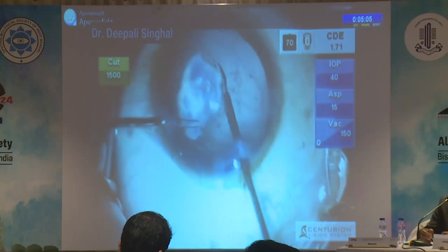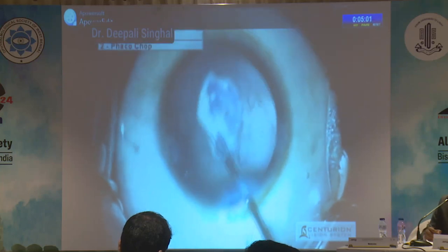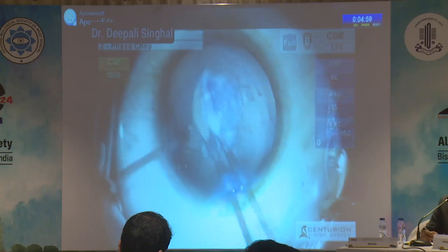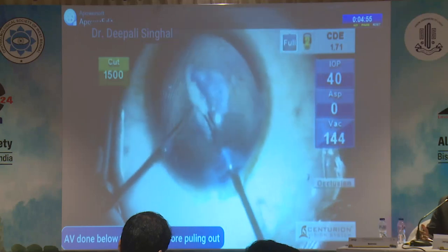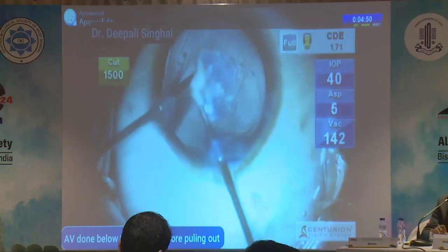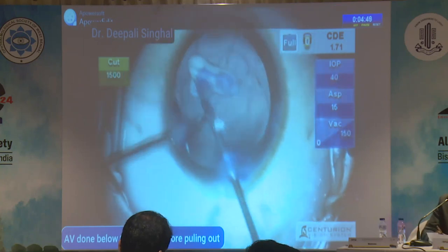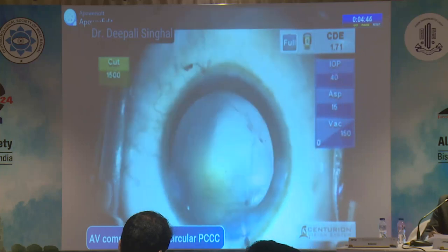But one part was left attached and held with forceps. First I did anterior vitrectomy below the plaque to remove any attached vitreous before pulling the plaque, to avoid any vitreous traction. Then anterior vitrectomy was done.